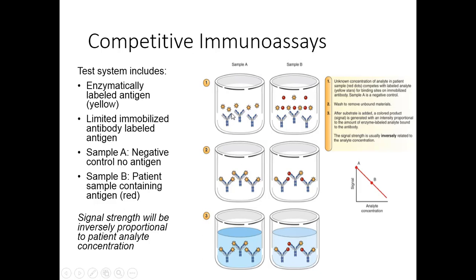But number two, we also want to make sure that it's sitting up in the right direction. It wouldn't do us any good to try and capture these antigens if our antibodies were upside down, for example, and the Fc region was up in the fluid. So immobilizing antibodies helps us to orient the antibodies the proper way, but it also makes it so that once this antigen binds to it, it doesn't get washed away in solution when we do that wash step.